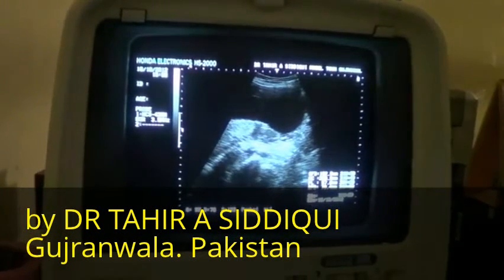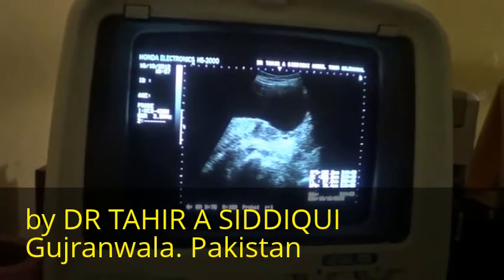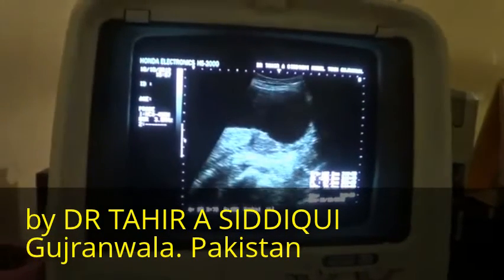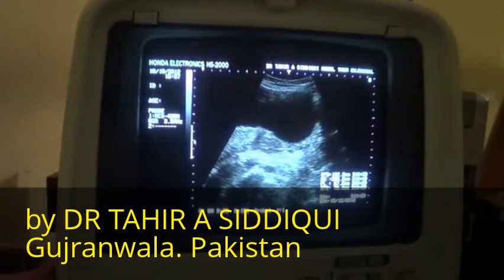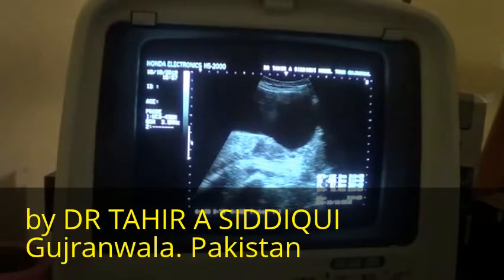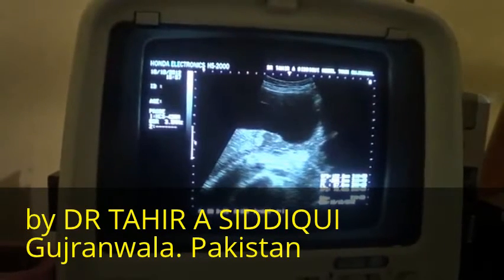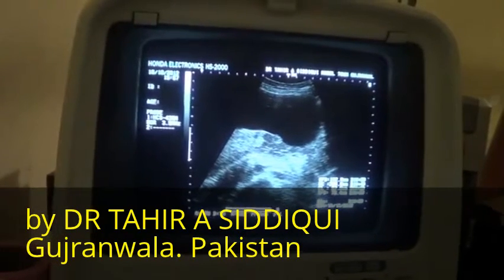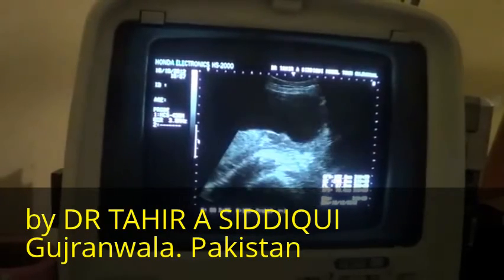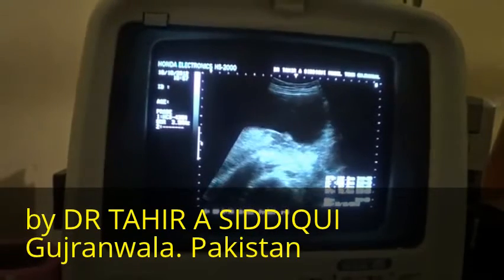This is a female obstetric ultrasound referred for large dates and to rule out any fetal anomaly. She has 2 kids which are normal. No history of cesarean.